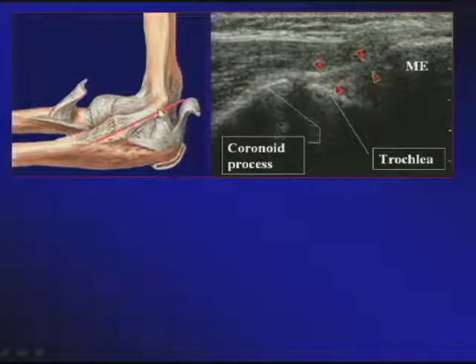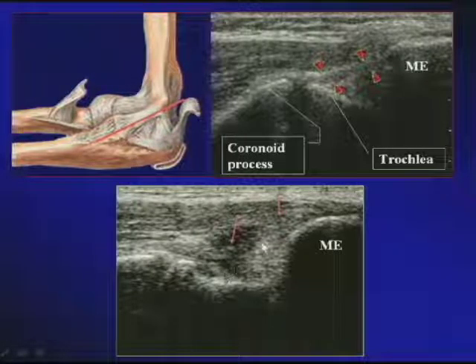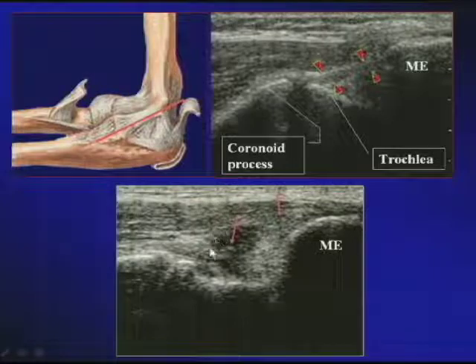When affected, the ulnar collateral ligament, the anterior bundle, as you could see on both Netter's drawing and on the grayscale imaging of ultrasound, you'll notice an interruption. Here one more time, the bone acoustic landmark of the epitrochlea, and as you bridge it towards the sublime tubercle of the coronoid process, you get to see a hypoechoic lesion interrupting the packed fibrillar pattern of the ulnar collateral ligament, compatible with an acute tear of the ulnar collateral ligament.